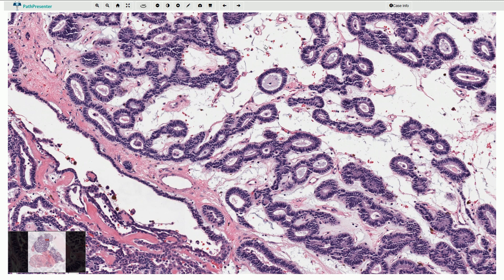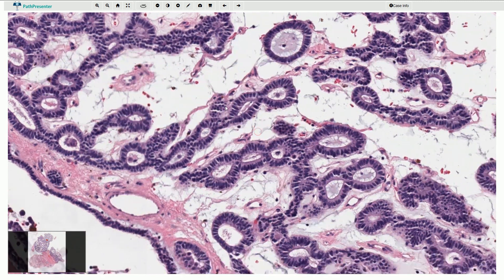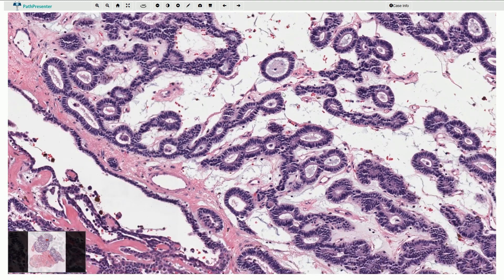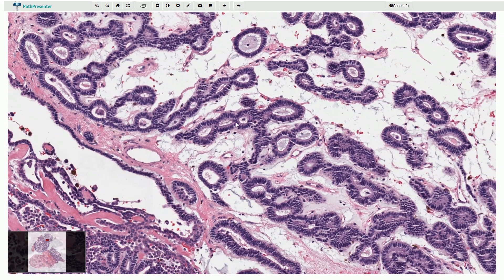The stroma is typically very loose and well vascularized. The cells are uniform columnar and they have elongated nuclei with basaloid features. The canaliculi often show a parallel arrangement as we see it here or here.